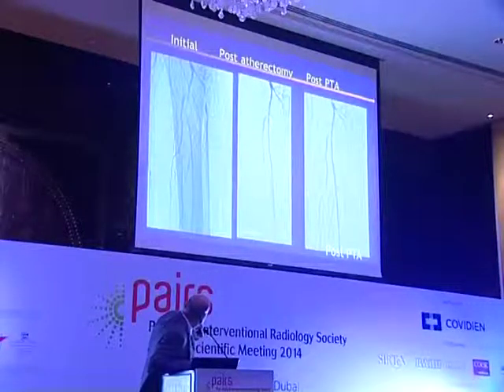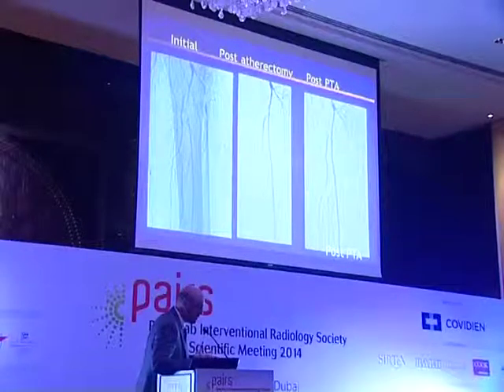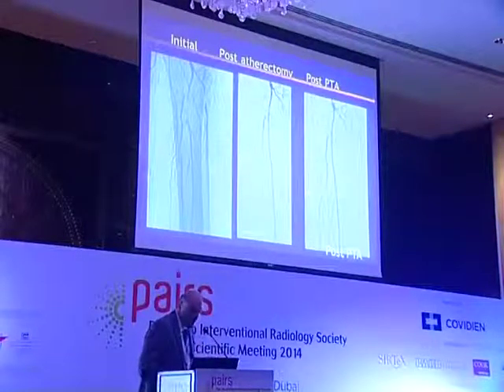the peroneal is diseased, and we followed the same concept as Dr. Razavi was mentioning: try to revascularize as many vessels as possible. So going after the peroneal, this is after atherectomy. It looks better, but after PTA, it's definitely more improved. You have good luminal gain.